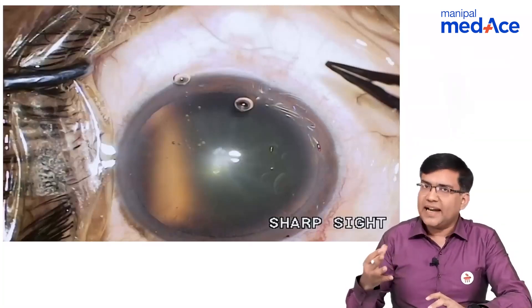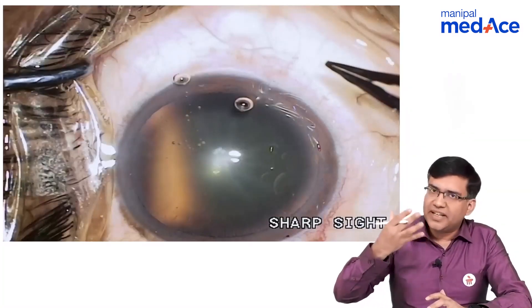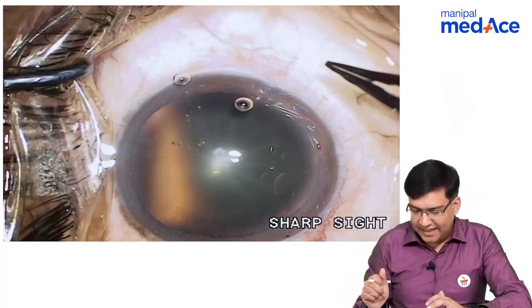Let us show you a cataract surgery so that we can understand the various steps that are done in the cataract surgery.